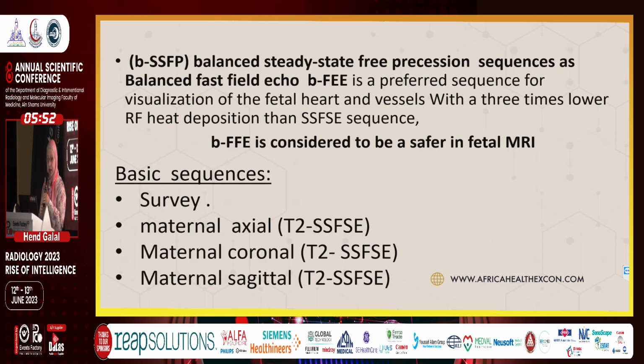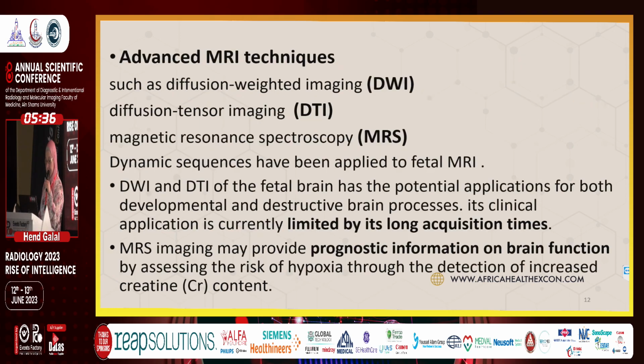As regards fetal MRI, we mainly use balanced steady-state free precession as we do in pediatric and adult age, because balanced steady-state free precession is safer in fetal MRI.